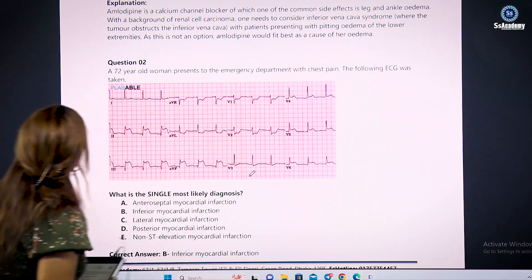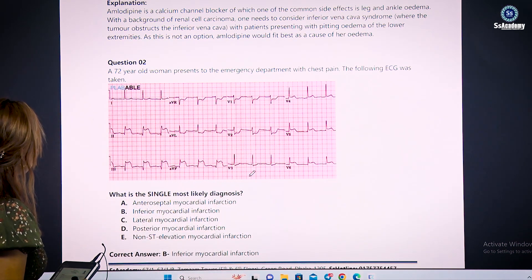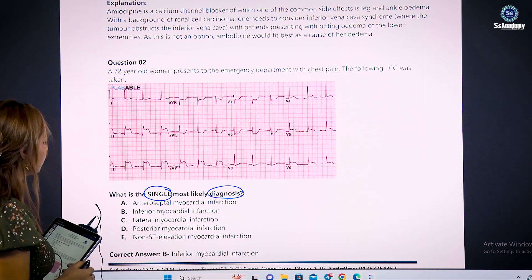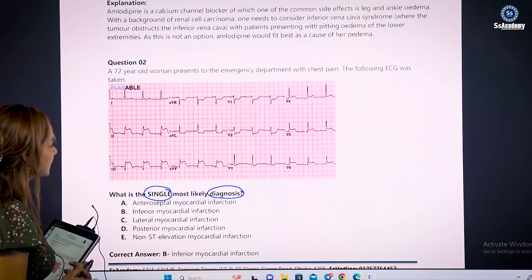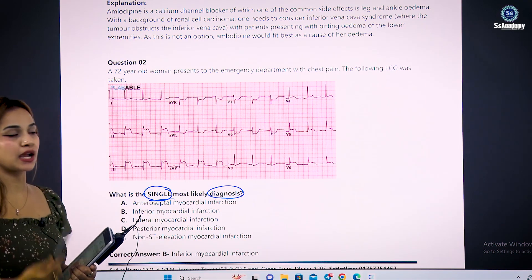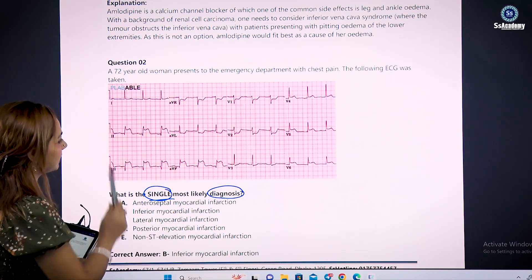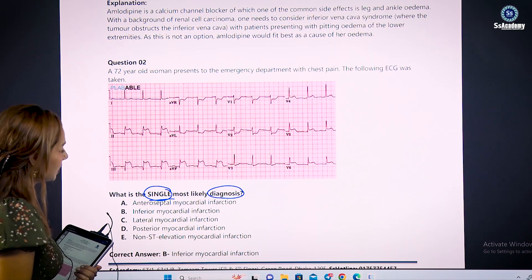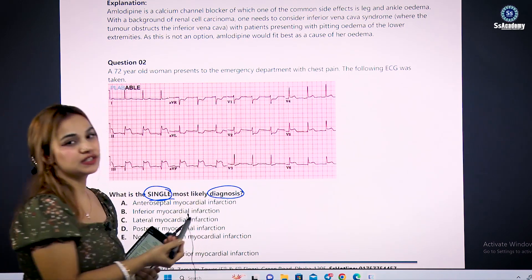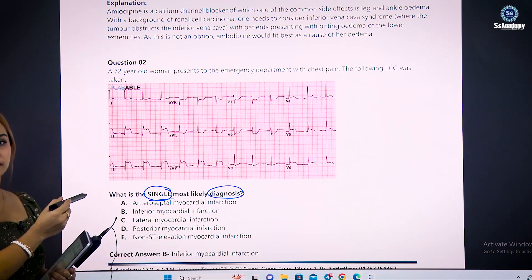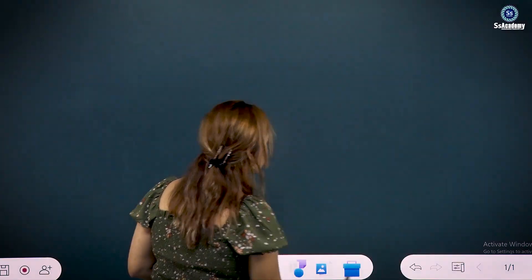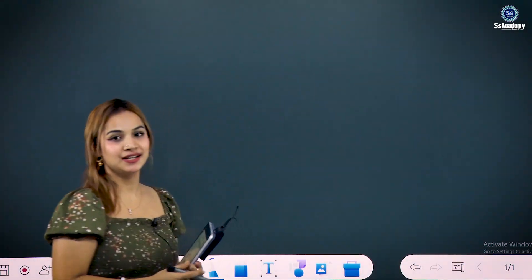The first question — question number two — asks: what is the single most likely diagnosis from the given ECG? To clinch the diagnosis directly from the ECG, you have to know some basic information about the ECG.